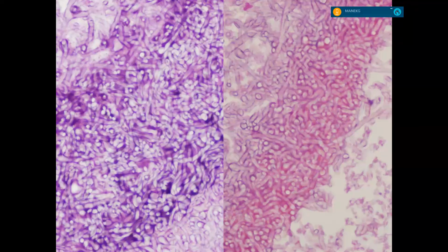That's completely fair. I was going with what you said earlier, that it is pauciseptate or aseptate. Yes, Mucor. I totally understand, but I'll give you the counter. Look here, where the walls are completely parallel and there is a septum there. It's tough, I'll grant you that. It's difficult. All right, so this is a fungus ball, mycetoma, aspergilloma, whatever you want.